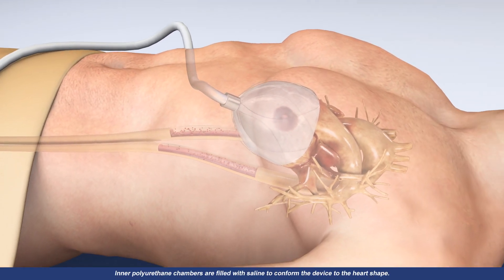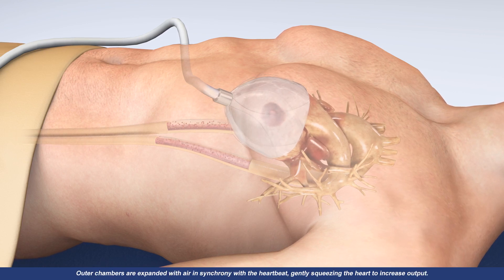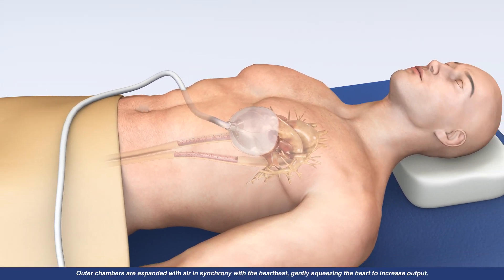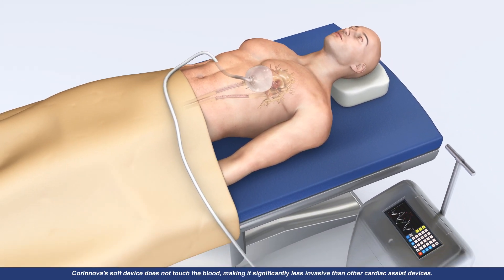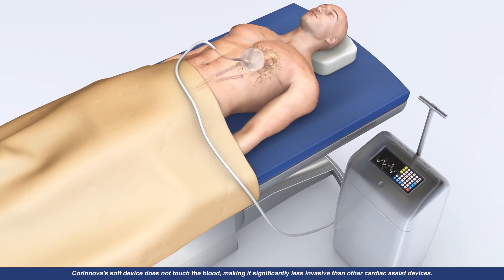Inner polyurethane chambers are filled with saline to conform the device to the heart shape. Outer chambers are expanded with air in synchrony with the heartbeat, gently squeezing the heart to increase output. CorInnova's soft device does not touch the blood, making it significantly less invasive than other cardiac assist devices.